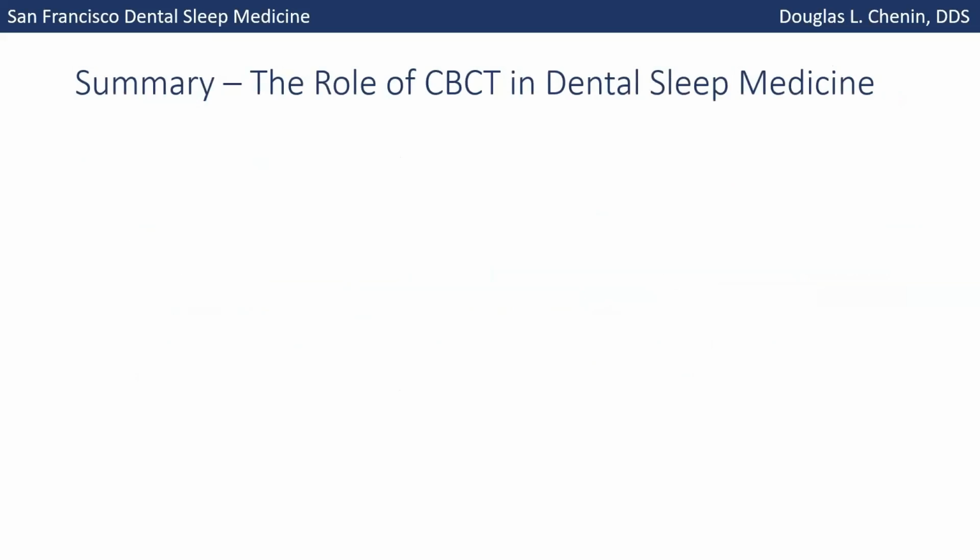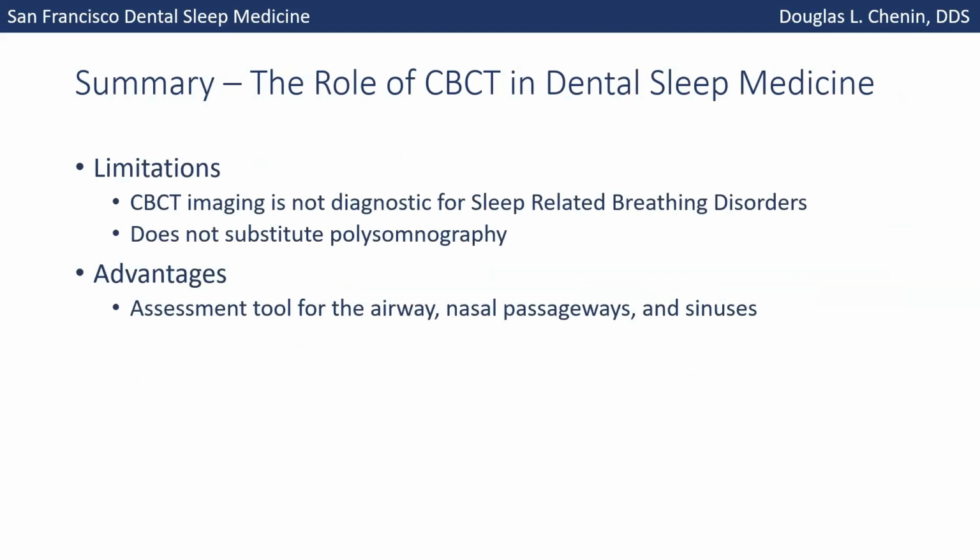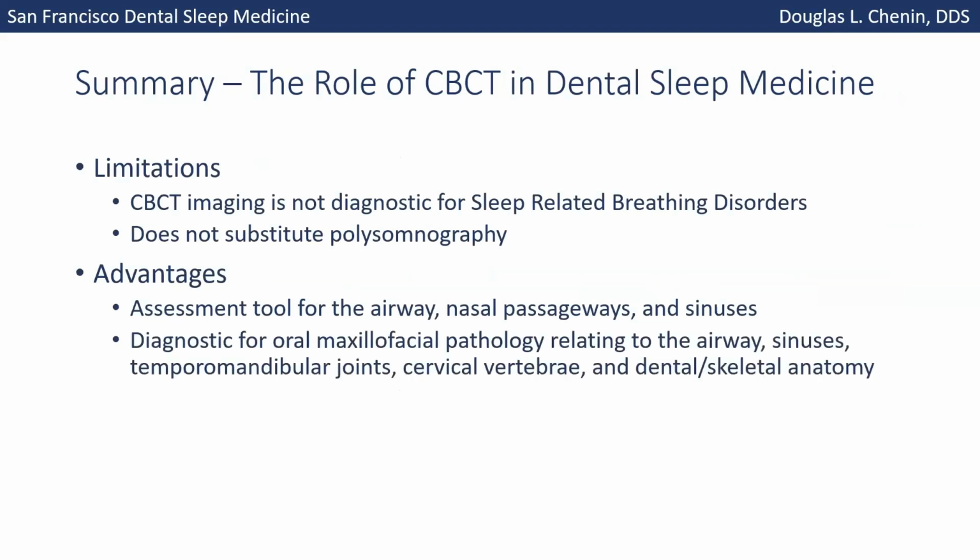So, big summary: there are limitations to the role of cone beam in dental sleep medicine. It does not give us diagnostics. It does not diagnose sleep apnea. We need the sleep study for that. It's not a substitute for sleep studies, but it gives us massive advantages. It's an assessment tool for the airway itself, the nasal passageways, and the sinuses. It gives us a diagnostic tool for oral maxillofacial pathology relating to the airway, the sinuses, the joints, the vertebrae, and just their general dental skeletal anatomy. It gives us that big three-dimensional understanding and baseline of the patient's anatomy.